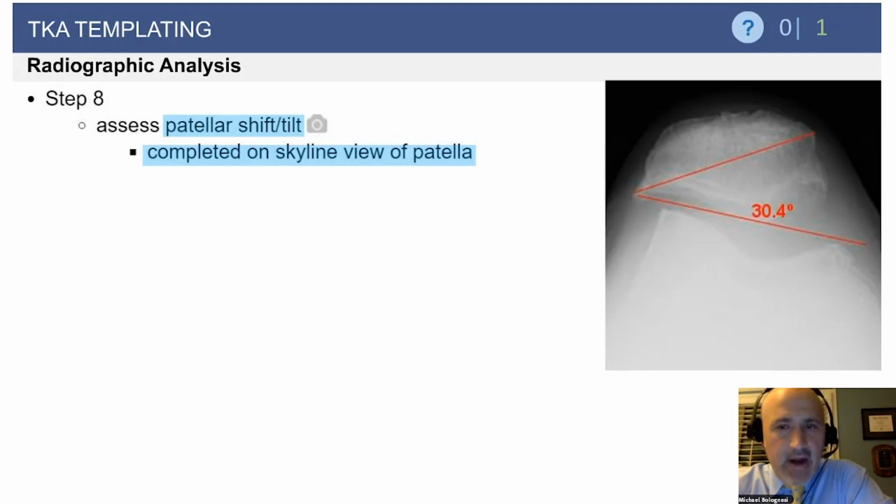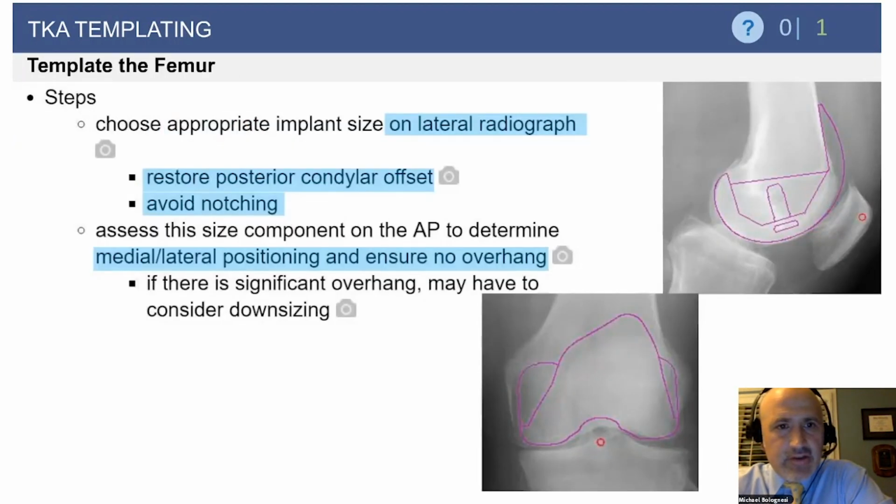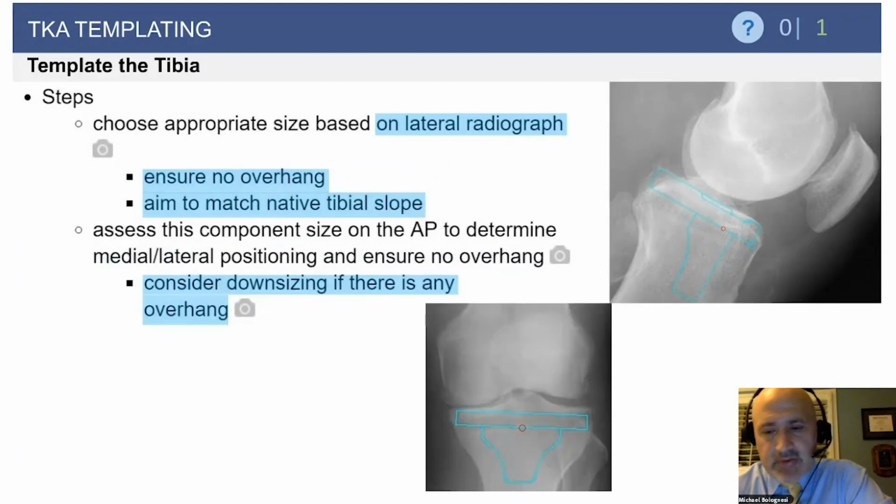It's important to think about patellar height, think about things like range of motion and concern about patella baja and what that might mean for exposure. I think this is very helpful. You want to make sure you know what the patella looks like so you can plan the appropriate resection. What you take off should look like the appropriate resection, and certainly helps you with tracking issues, making sure you know how much lateral release is done.